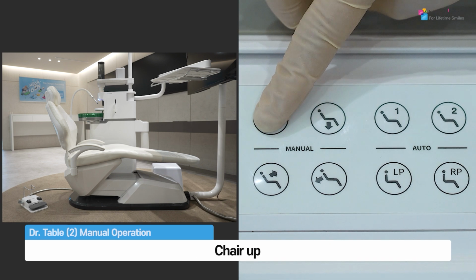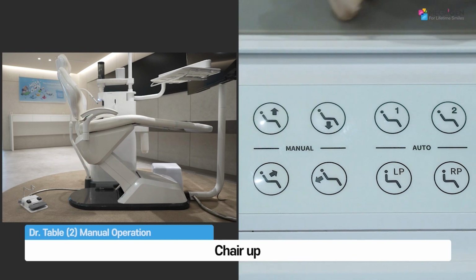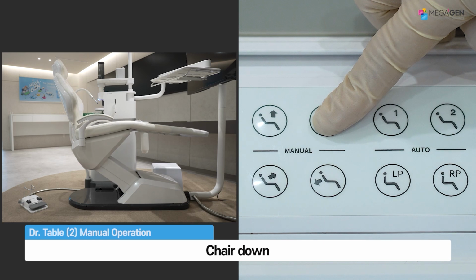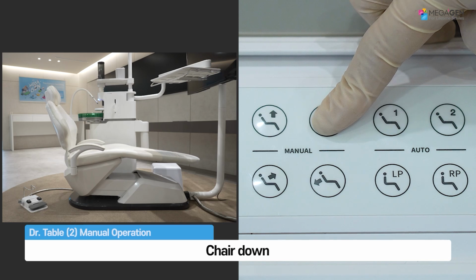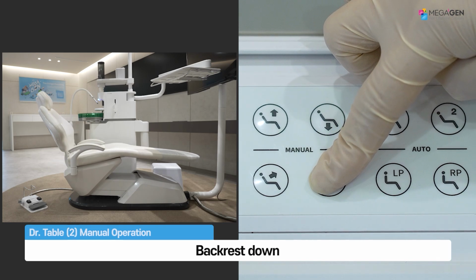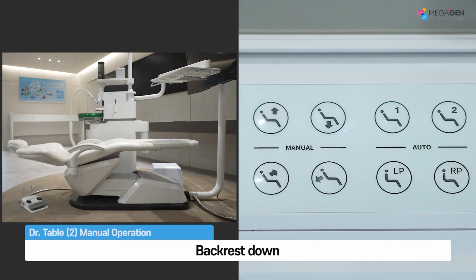Chair up, chair down, backrest down, backrest up.